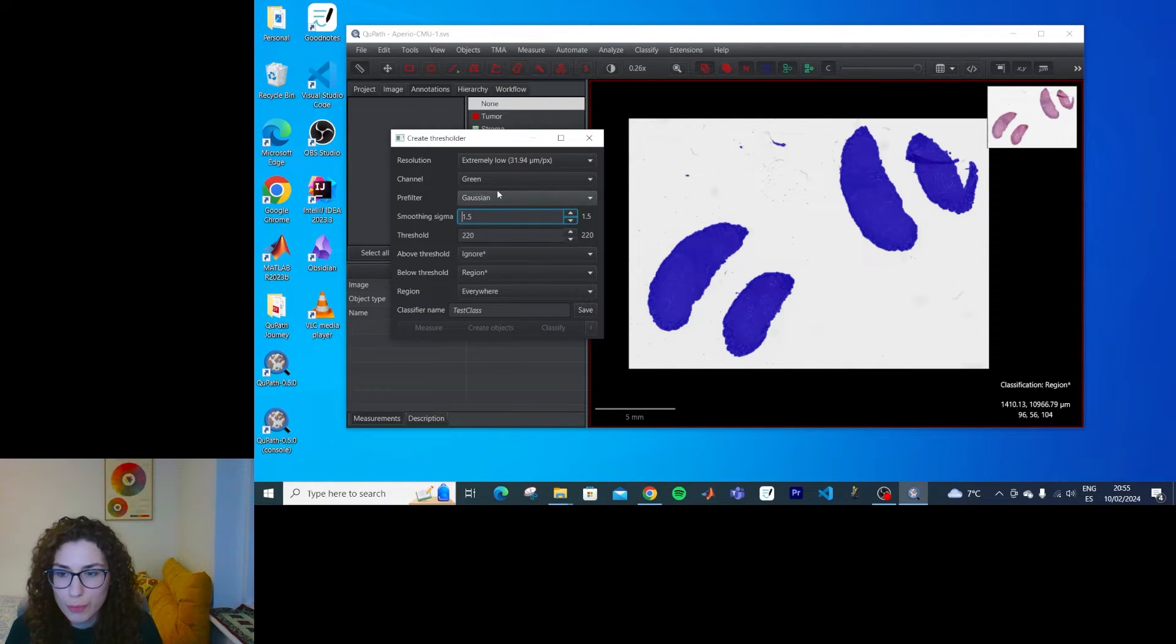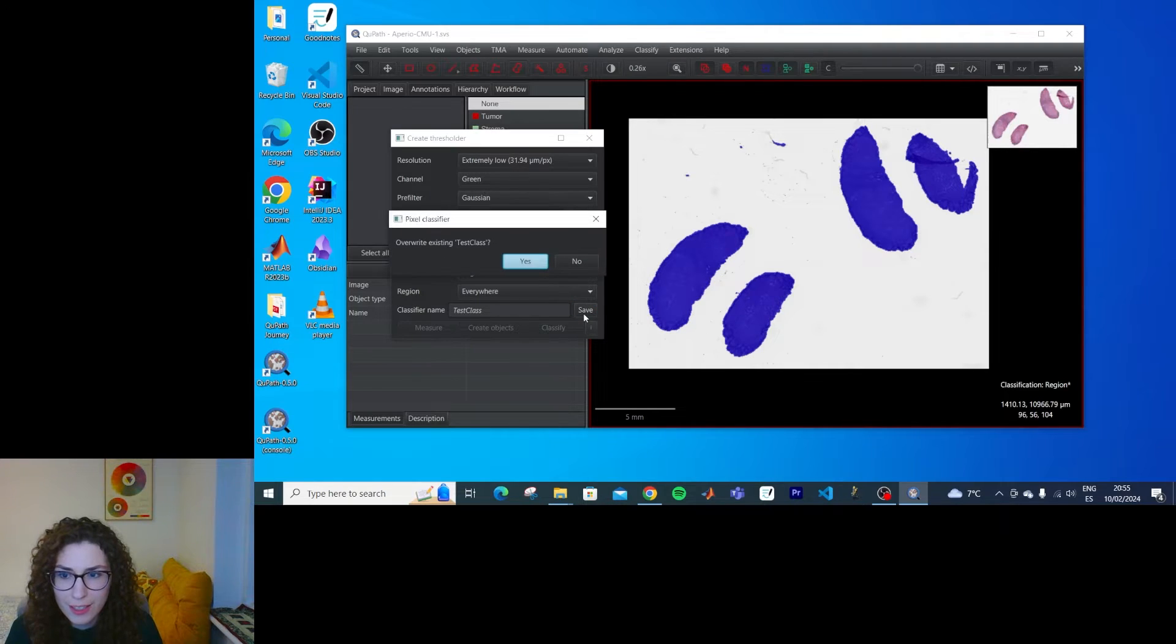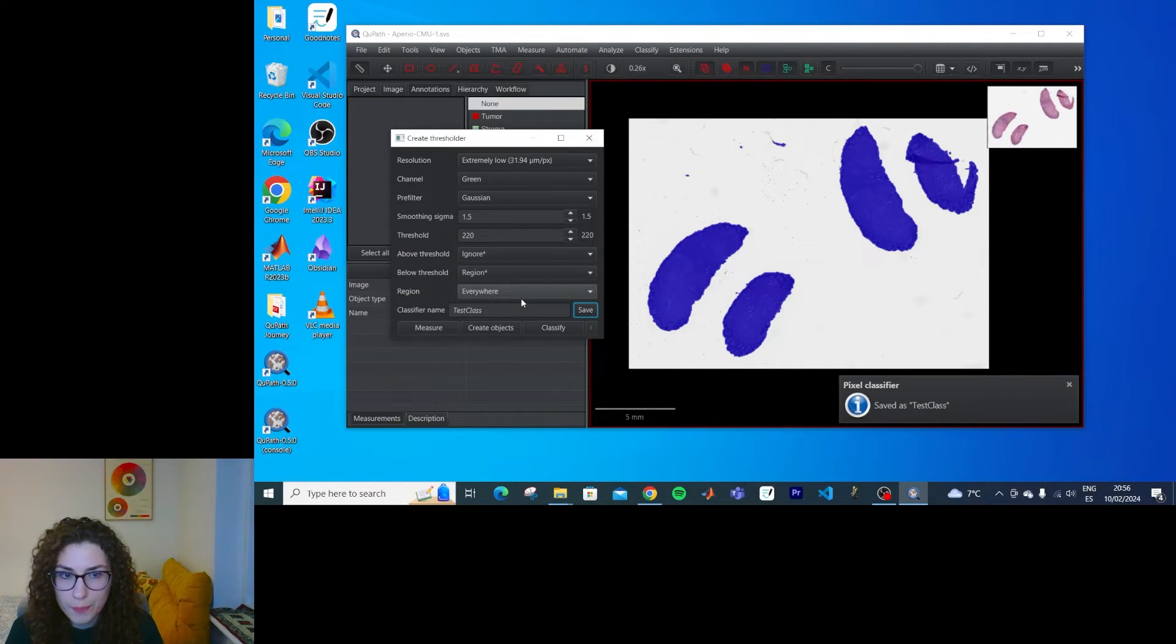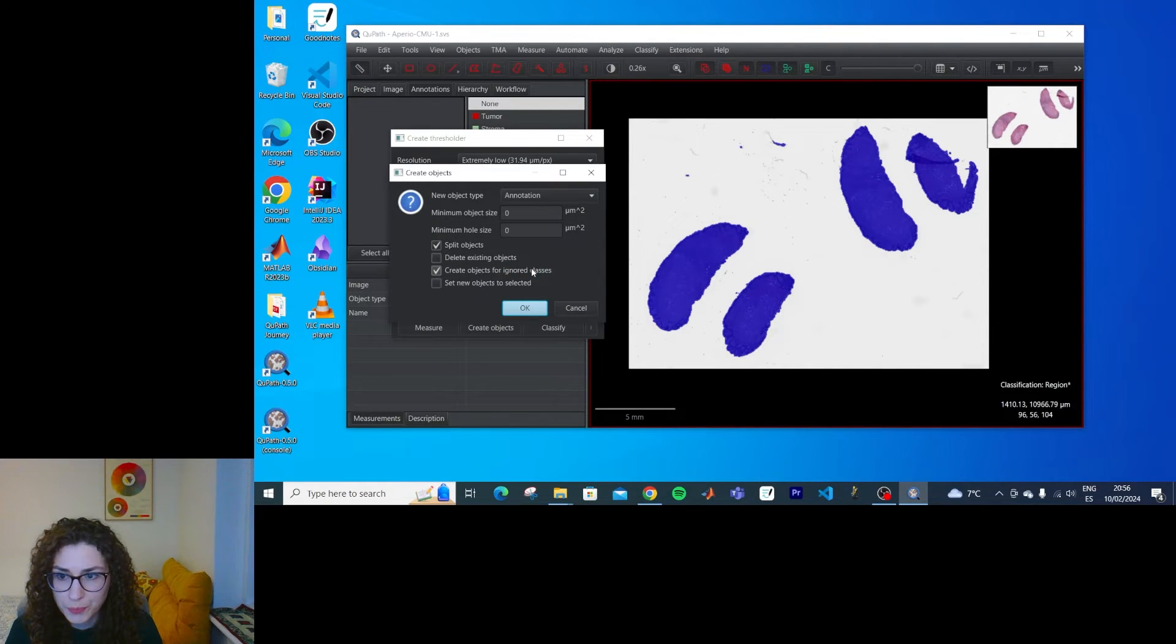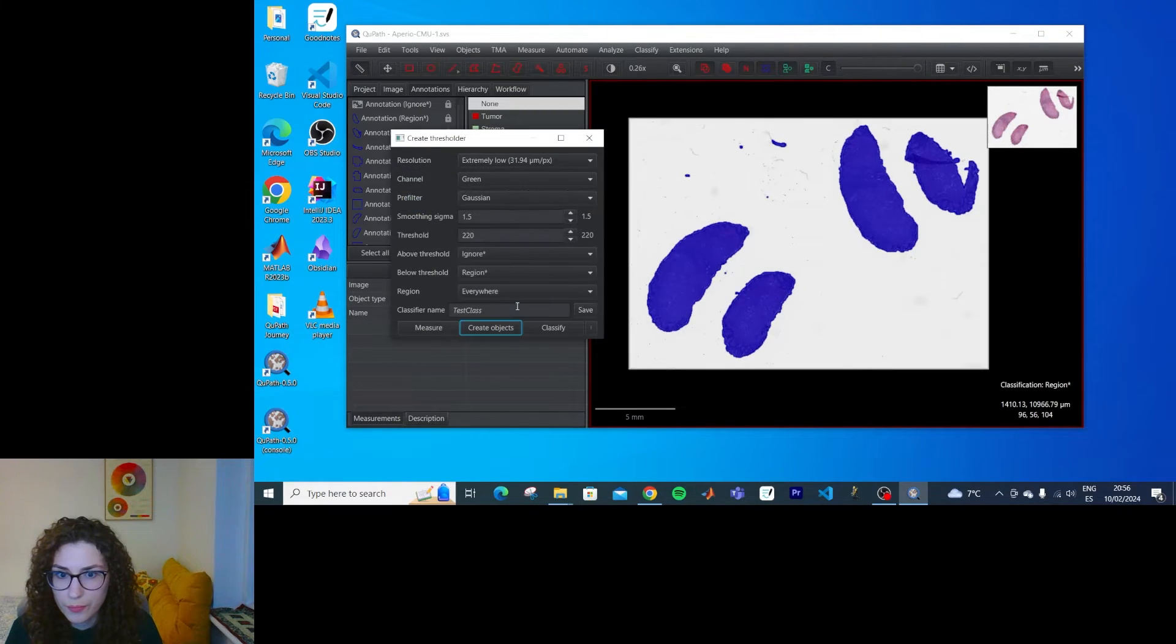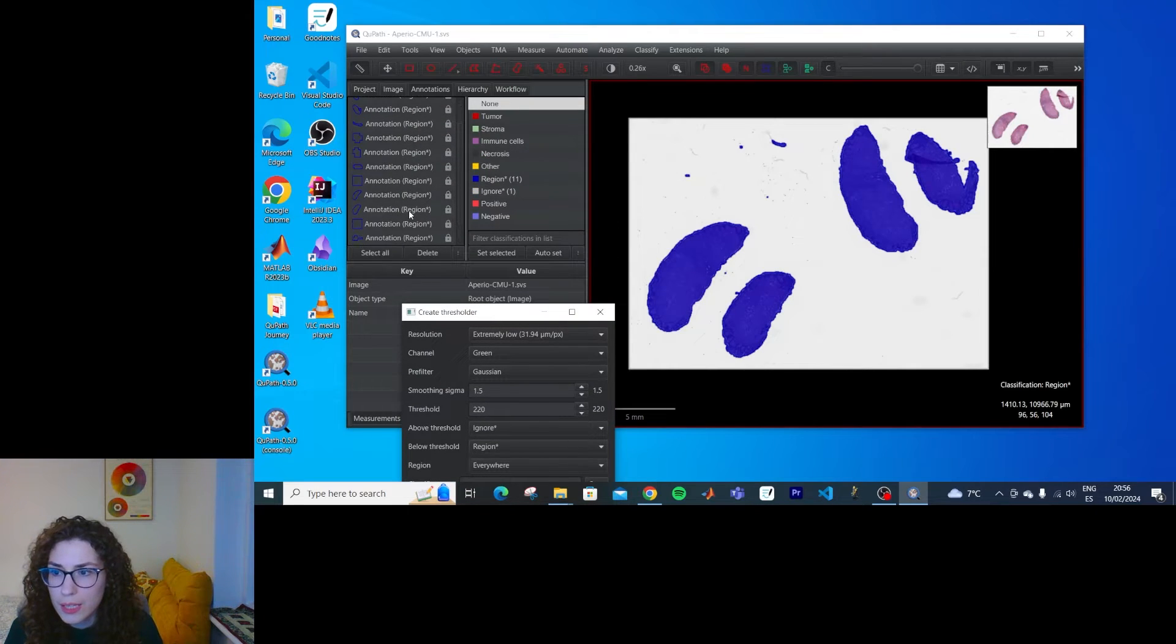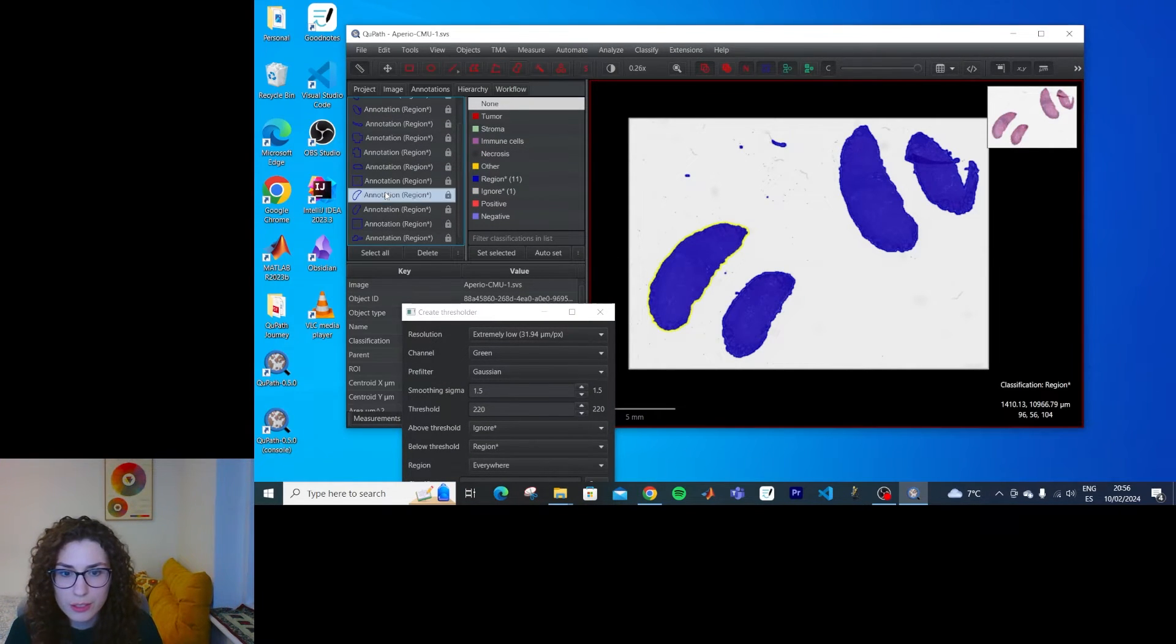Okay, now I have a much broader classification, so I think it should be okay. I should be able to get the annotated objects. So let's create the objects. And I get a lot of weird regions.